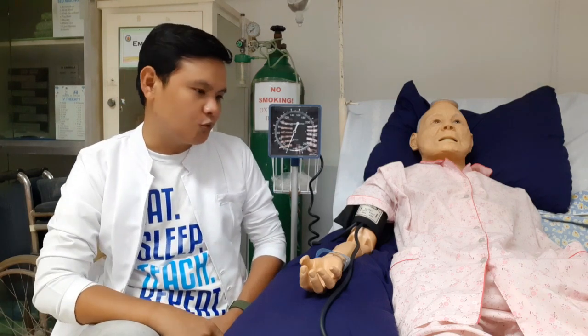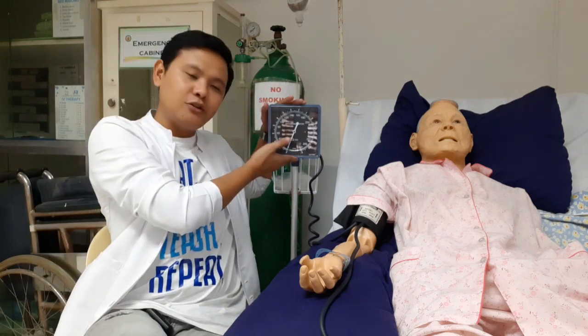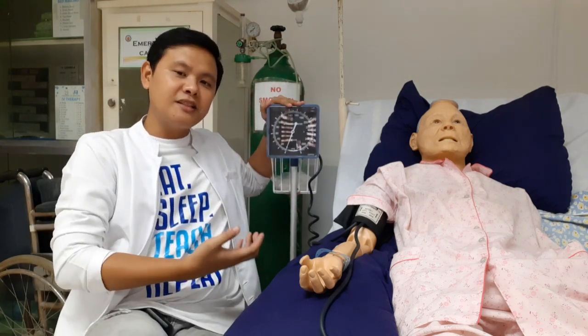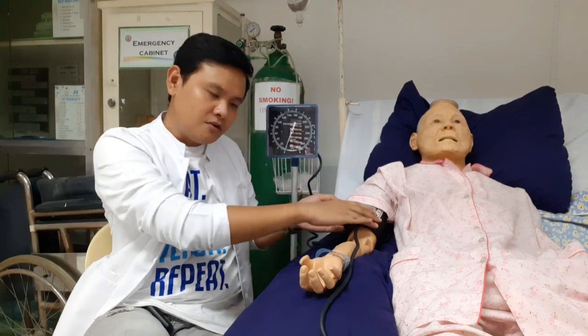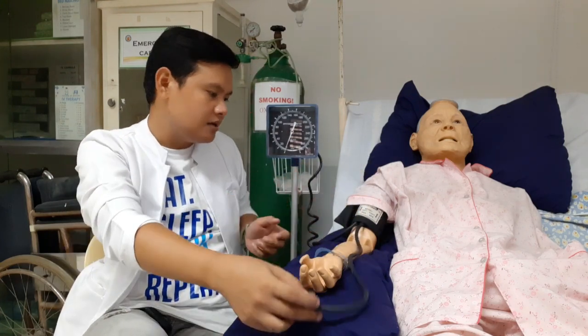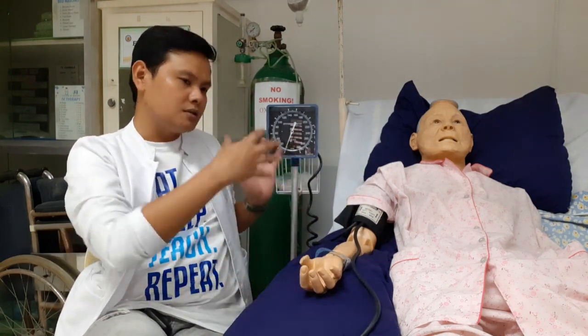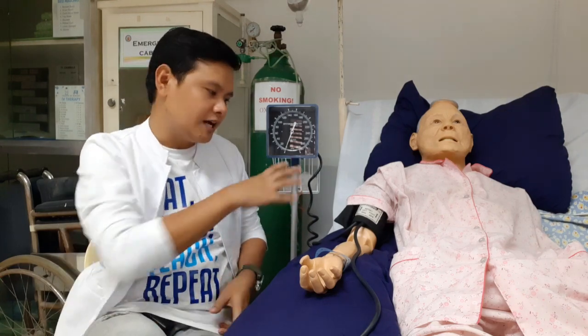So, okay. After determining, let's move on to the planning. Ano dapat nating i-plano? Okay, of course, we have to plan for the sphygmomanometer. Kailangan meron tayo ito. Assemble natin yung mga materials and equipment na gagamitin natin, such as the sphygmomanometer, the BP cuff. Okay, and then we also have here the bulb. So it comes in one. So magkakasama na yan. So some they call it the BP apparatus.